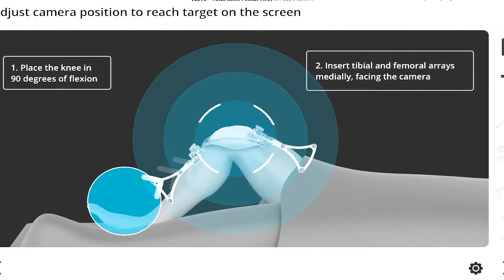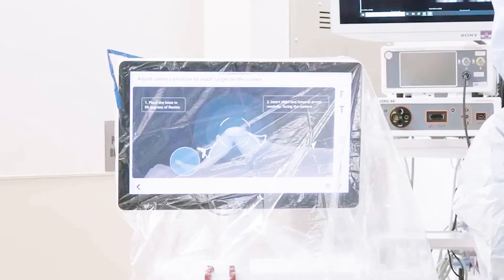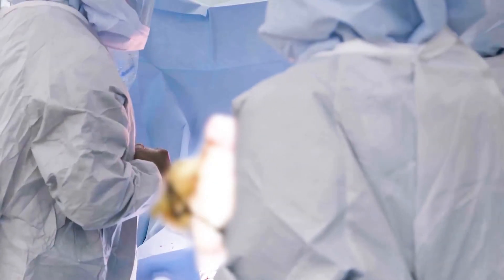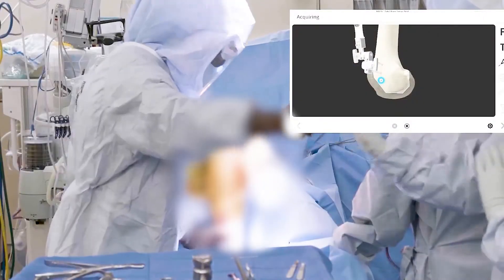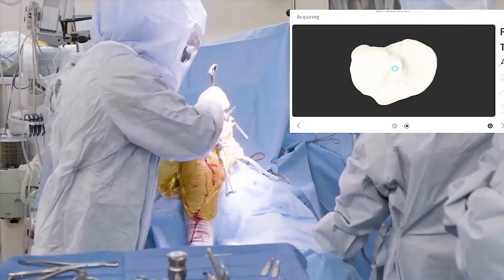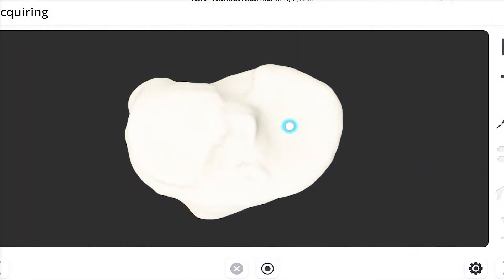To begin the procedure we will place the knee in a particular position so that the robotic system can see the knee throughout the range of motion. Once we have adequate positioning of the robotic system in relation to the patient's knee, we will move on to the next step which is registration. During registration, your surgeon will register certain areas on the knee itself so the robotic system recognizes the patient's unique anatomy.